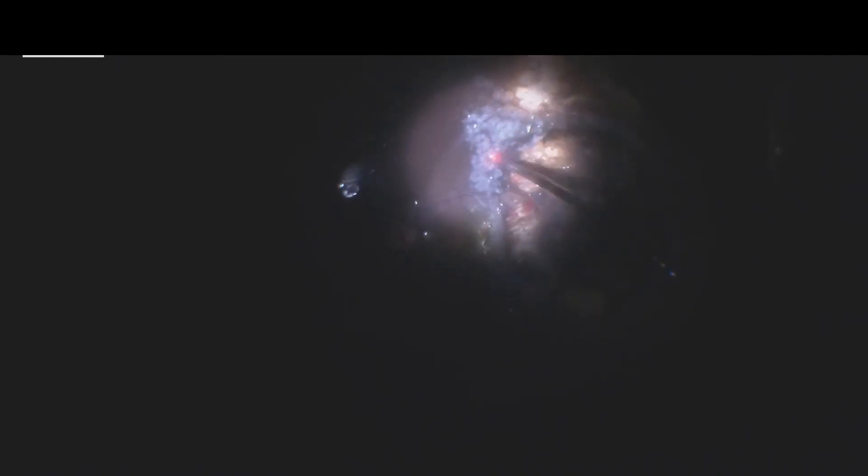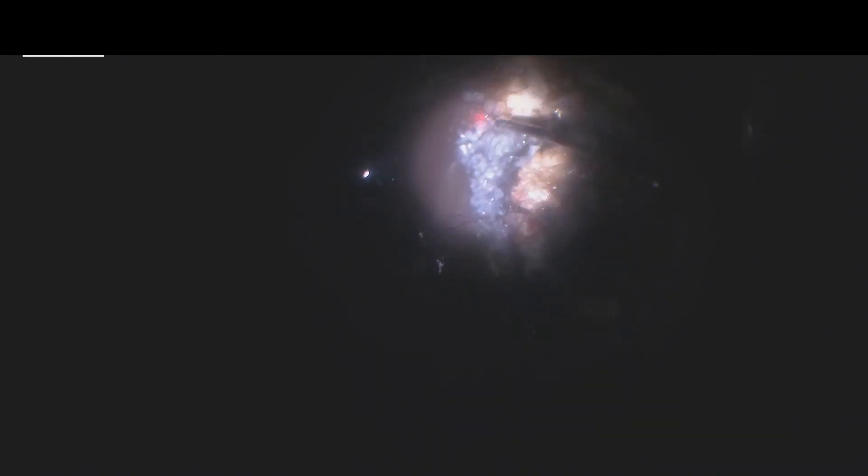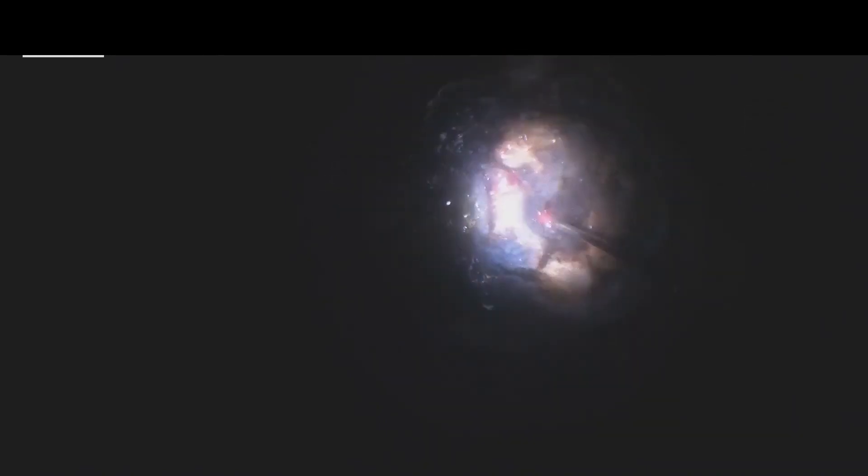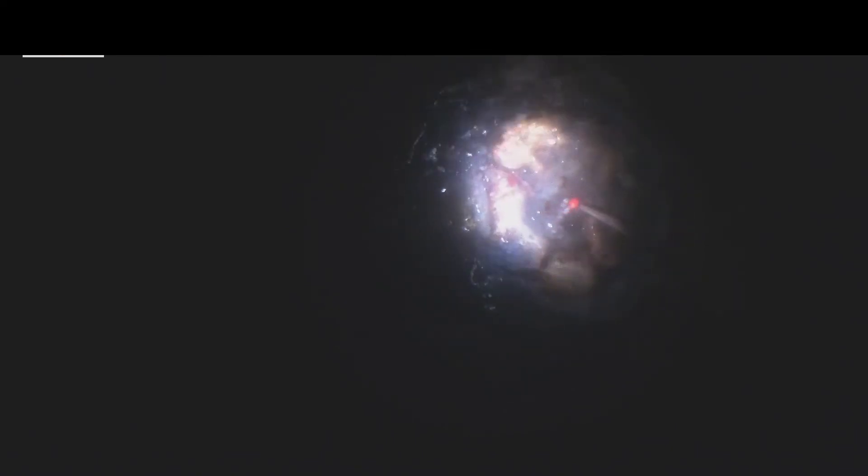The edge of the retinal flap is treated with the green laser. The pigments over the bare sclera were also treated with the laser, and the remnant tumor is also treated with the red laser.